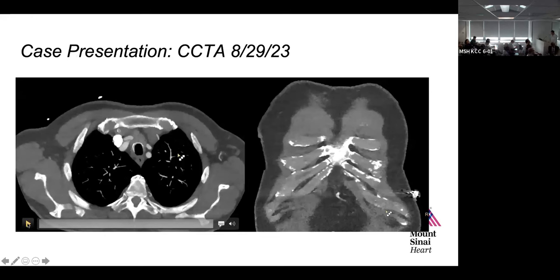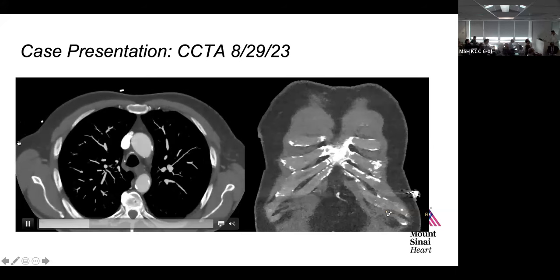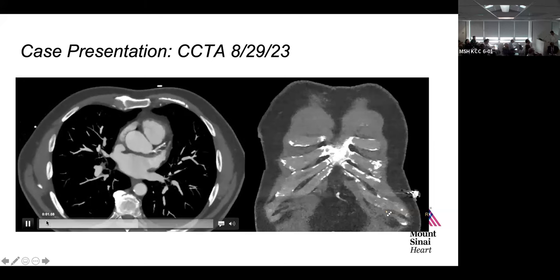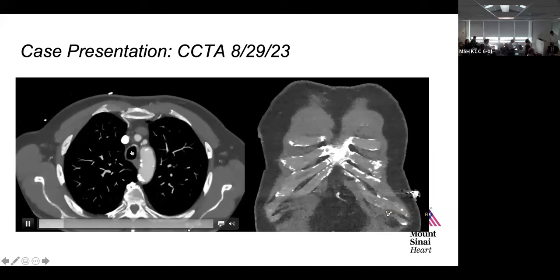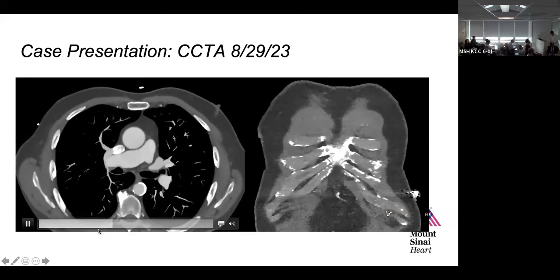And Dr. Zaidi, if you could take us through, we have the axial, we have the coronal that really show this defect quite nicely. And then I have some still shots of the defect so we could see it really nicely as well, but we can take them through first. This is the axial cine kind of going through. You can just orient the. Absolutely. So we have the, again, same thing. We have the aorta here. These are the pulmonary arteries here. We start over. We have some arch vessels up here. And then this, with the contrast coming in, is the SVC here. And then right there, we can see our first view of the anomalous venous return.